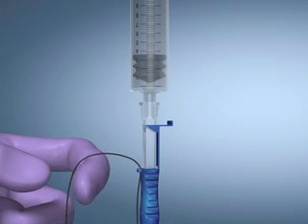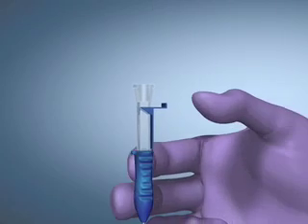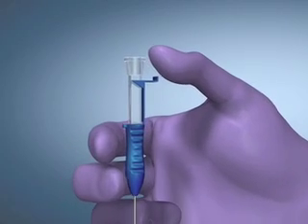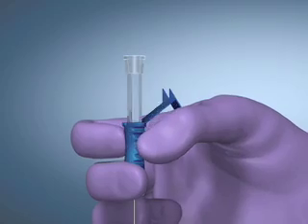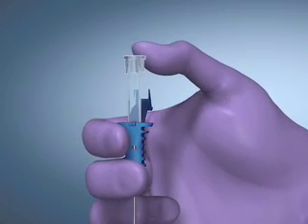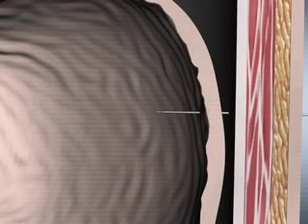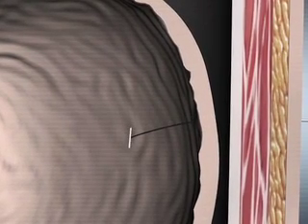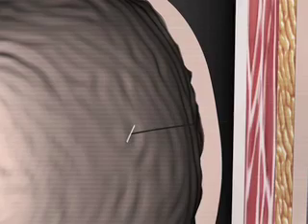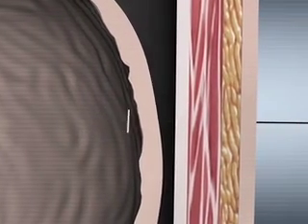After confirmation of correct position, release the suture strand and remove the syringe from the device. Bend the locking tab on the needle hub. Firmly push the inner hub into the outer hub until the locking mechanism clicks into place. This will dislodge the T-bar from the end of the needle and lock the inner stylet into position, blunting the needle. Withdraw the needle while continuing to gently pull the T-bar until it is flush against the gastric mucosa.